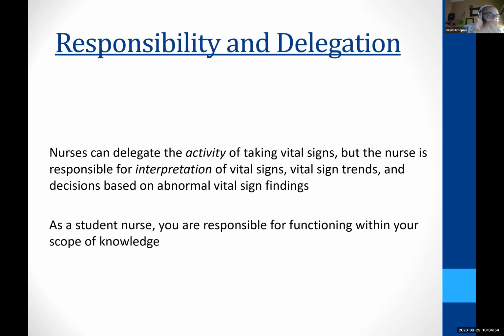Now, again, blood pressure, we want to check a manual. Now, what if somebody says their urine's gone down? We haven't really talked about urine, but if someone says, oh, I thought their urine looked weird, go check it. Go open up the chart. See, have they been urinating normally? Has it been a normal amount? What is their normal amount? Go through it. The finger device measures oxygen by putting infrared light through your fingers, going through the red blood cells, and it can measure the amount of oxygen in those red blood cells.